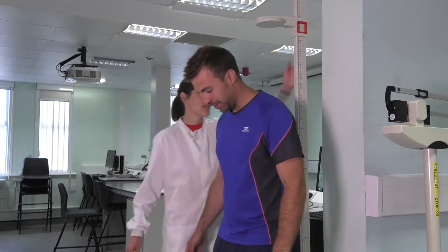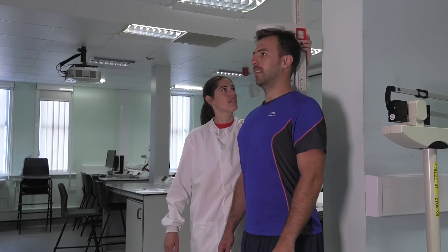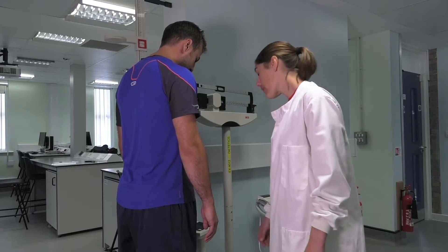Then you need to take their height and weight to be able to input it into the MetaSoft software. Height and weight needs to be in kilograms and centimetres.